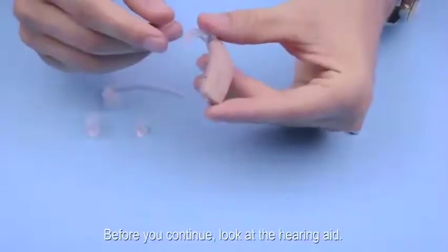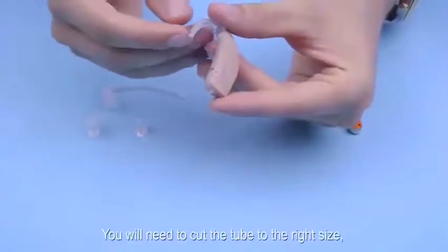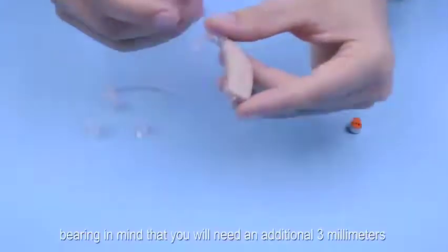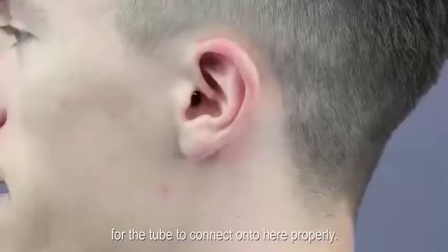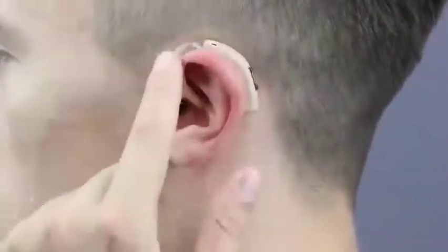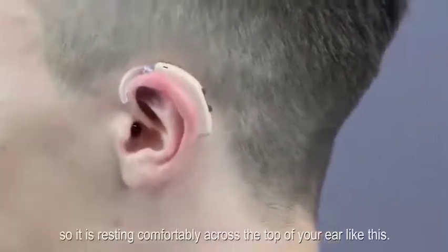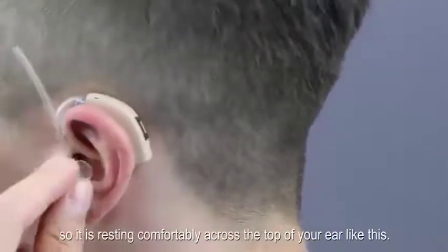Before you continue, look at the hearing aid. You will need to cut the tube to the right size, bearing in mind that you will need an additional 3mm for the tube to connect onto the hearing aid properly. Now put the hearing aid on your ear so it is resting comfortably across the top of your ear like this.